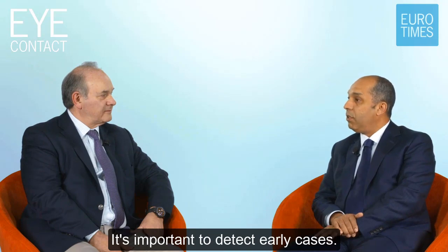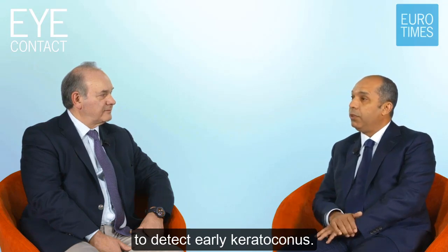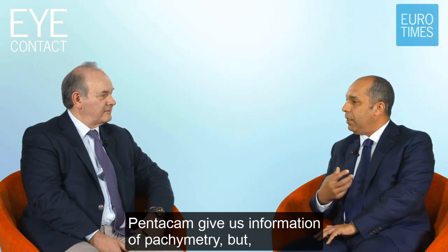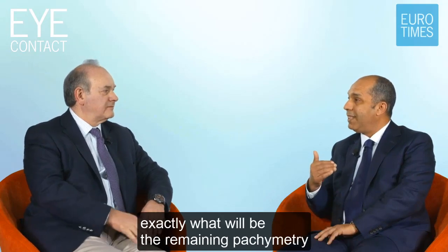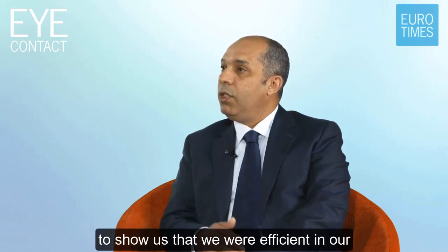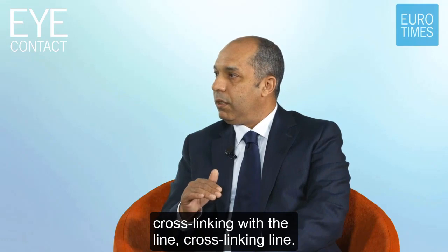It's important to detect early cases, and now we know the role of epithelial mapping to detect early keratoconus. Also, it's very important to know exactly the pachymetry. Pentacam gives us information of pachymetry, but OCT is more accurate in giving us this information. It's also very important in cross-linking. Before cross-linking, because we know exactly what will be the remaining pachymetry after taking off the epithelium, but also it's very important after cross-linking to show us that we were efficient in our cross-linking, with the cross-linking line.